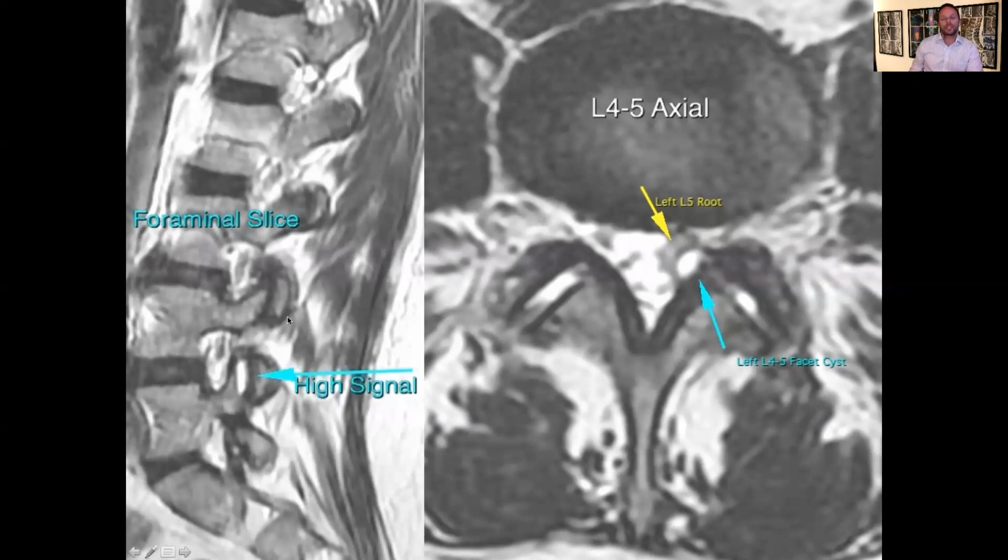She went and saw a therapist who did 10 treatments of therapeutic ultrasound. Now, this therapist believed that this patient had a disc prolapse or a disc herniation, which was affecting the sciatic nerve. And they thought by doing the ultrasound, it would help to reduce the inflammation around the nerve, and it would equally help to calm things down. Unfortunately, she had 10 treatments of the ultrasound and it never worked.